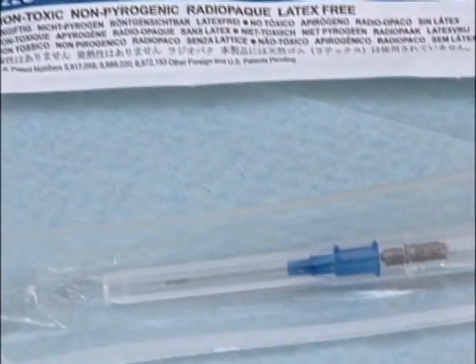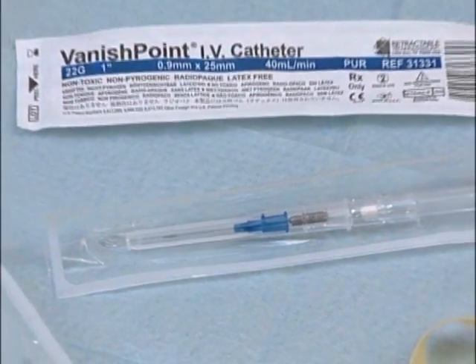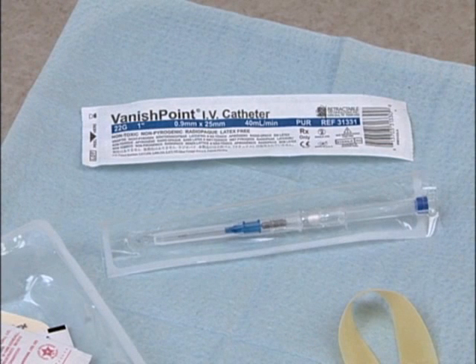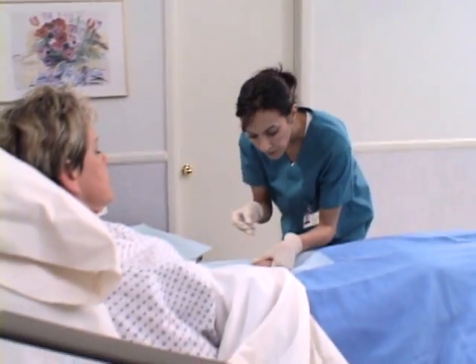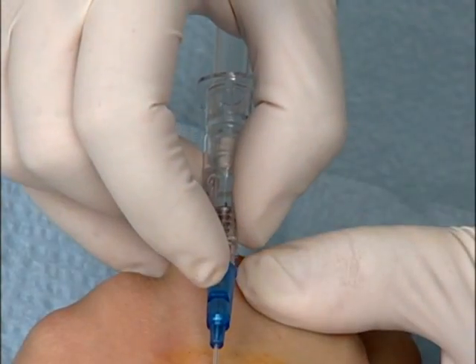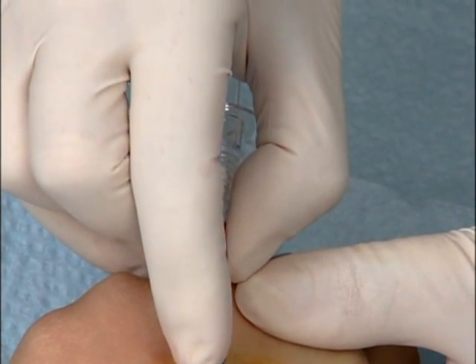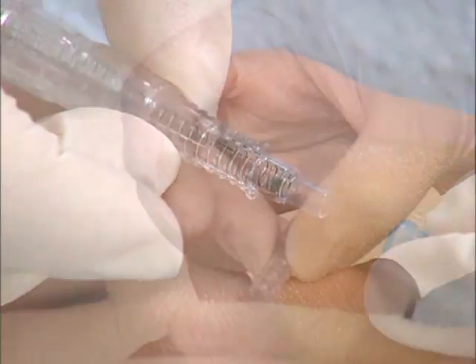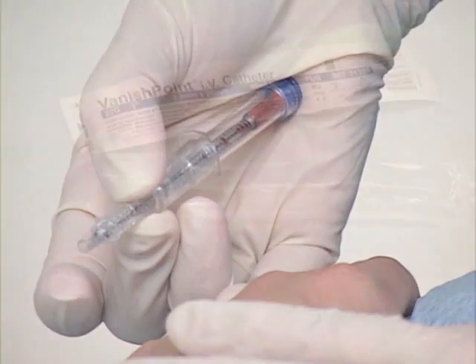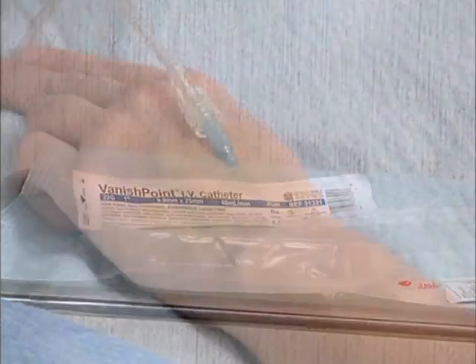Retractable Technologies has developed the Vanishpoint IV catheter to answer the demand for a safer IV device and meet OSHA's criteria for an engineered sharps injury prevention device. The Vanishpoint IV catheter is designed for safety. It is easy to use and allows for one-handed venipuncture. It contains an integrated safety mechanism that, when activated, quickly and safely retracts the introducer needle, which remains safely retracted inside the housing until disposal. The catheter remains in place for normal IV use.